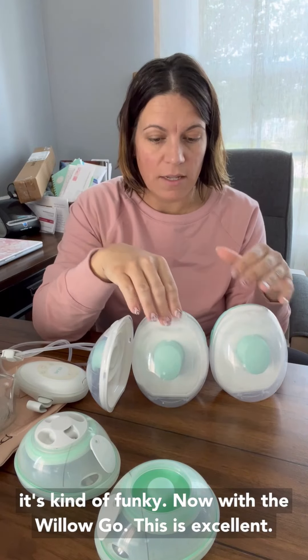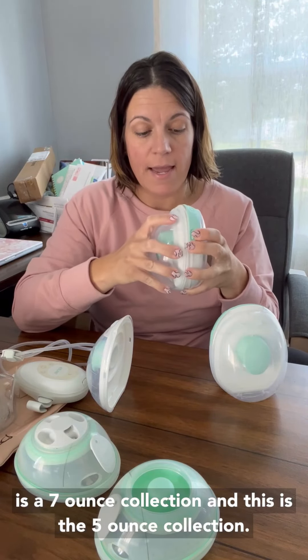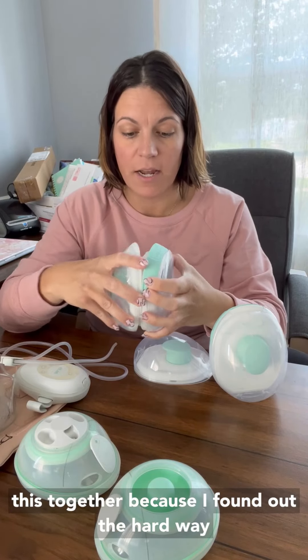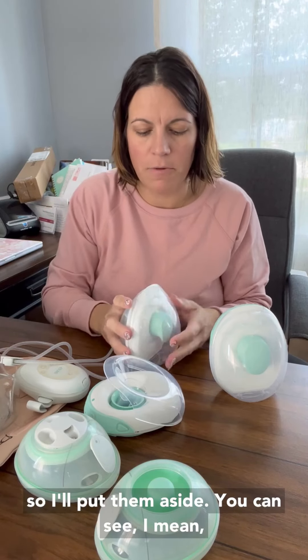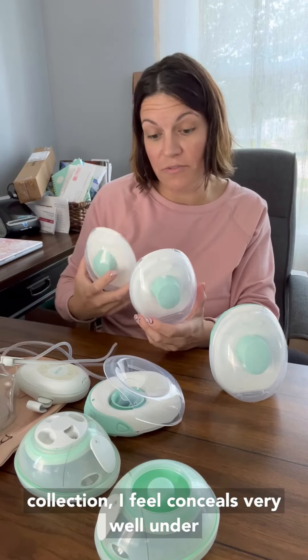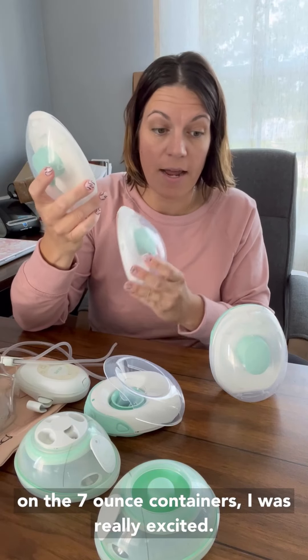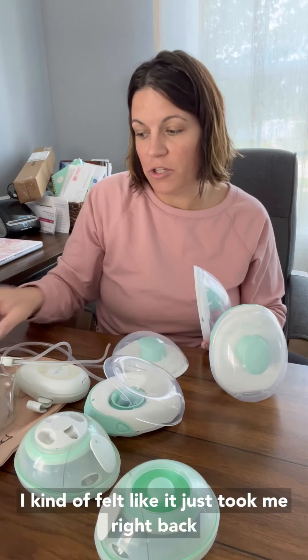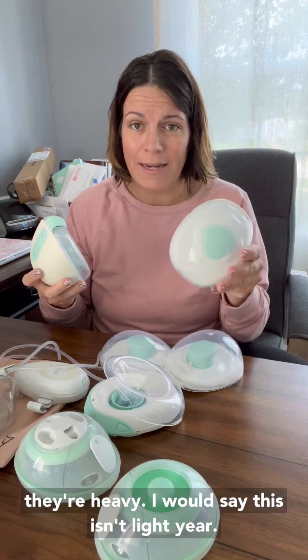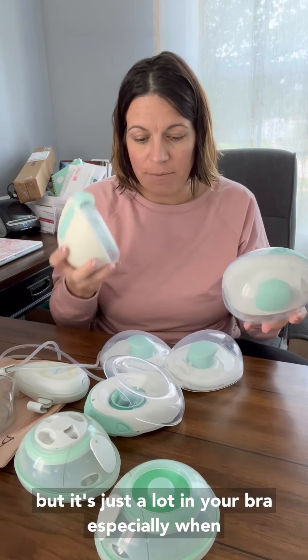Now with the Willow Go, this is excellent. There's nothing stopping this contour and it's pretty good. This is the 7-ounce collection and this is the 5-ounce collection — there is a big difference. You can see I mean there is a difference for sure. The 5-ounce conceals very well under my bra and t-shirt. I was really impressed. When I got the 7-ounce containers I was excited, but I was a little bummed because it felt like it took me right back to the 3.0, which I'm not a fan of size-wise. And they're heavy — it's just a lot in your bra, especially when you go up to the 7-ounce.